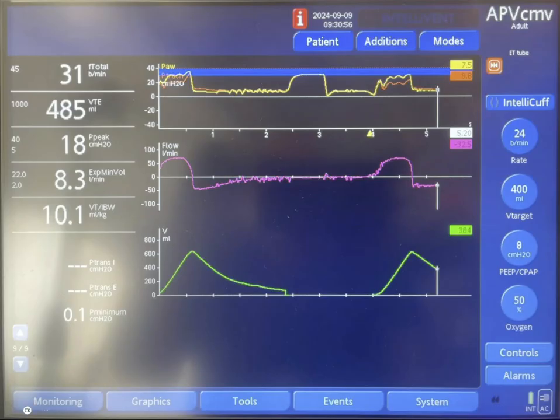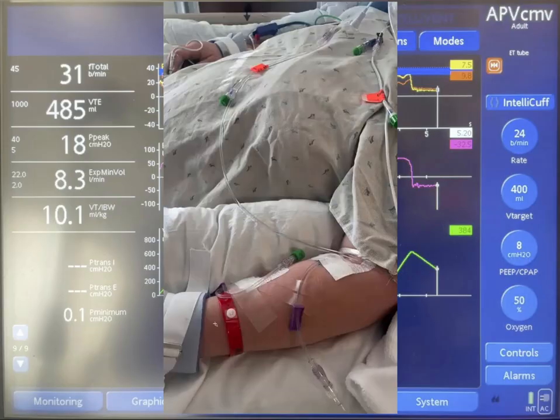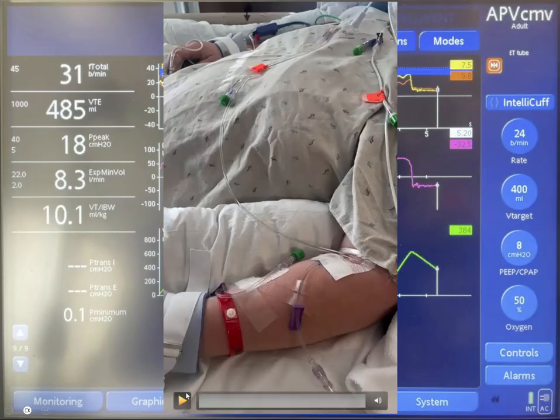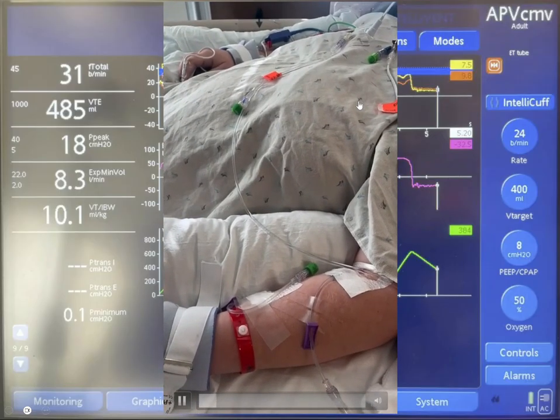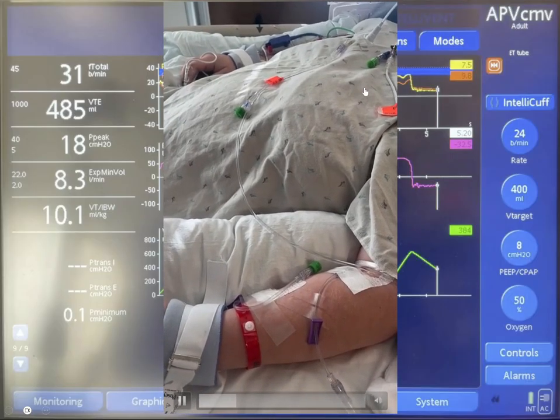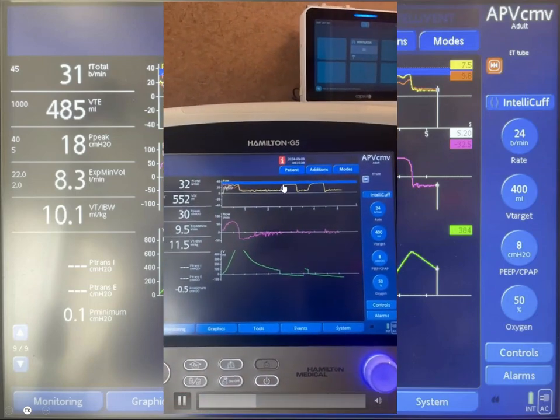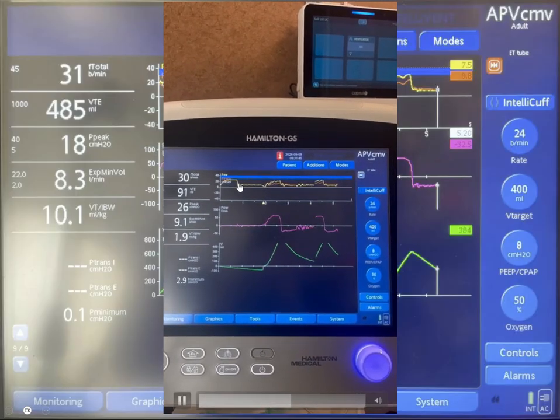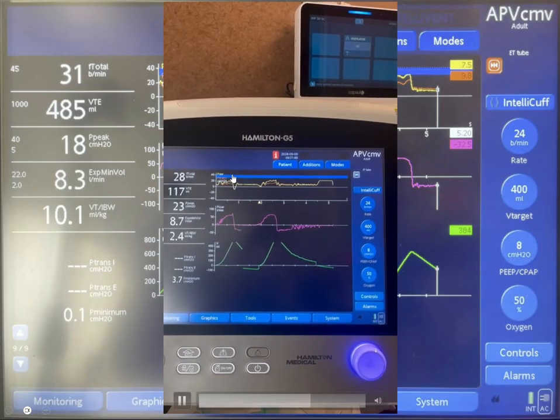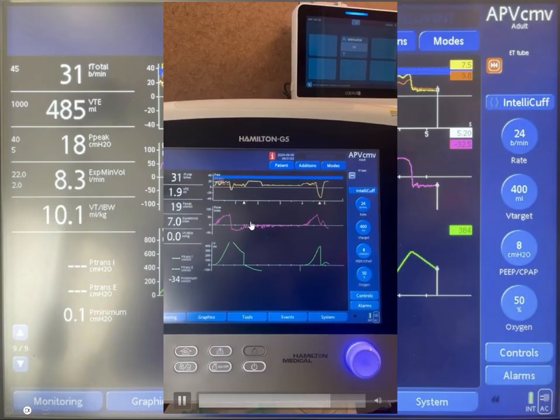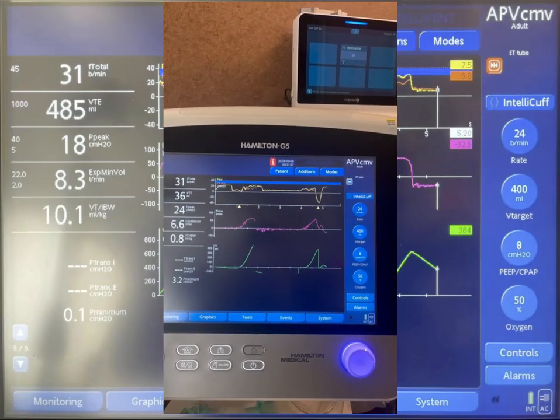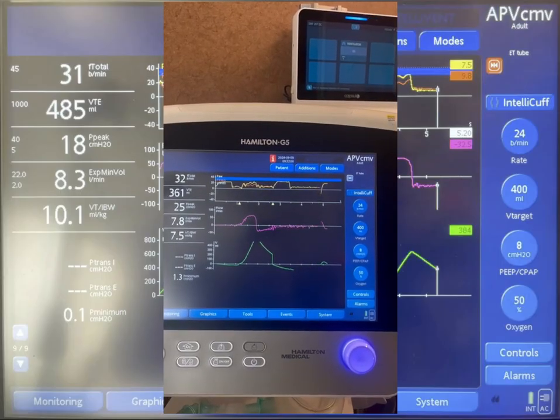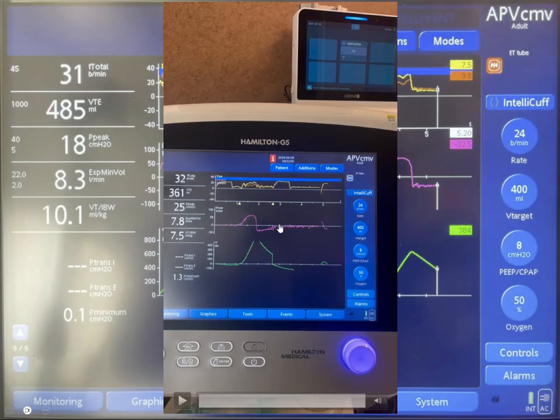Let's take a look at the video and see how the patient is breathing. You can observe the cycles of exhalation and inhalation. During exhalation of the patient, the machine is attempting to deliver a breath, but there is no air at all — no air is delivered into the patient. This is very strange. During this time, there is no flow at all.